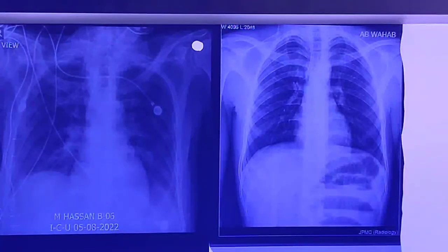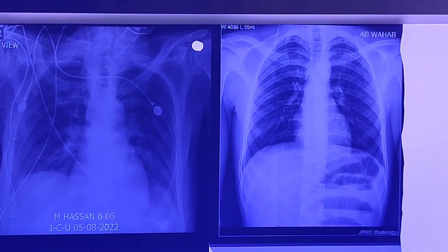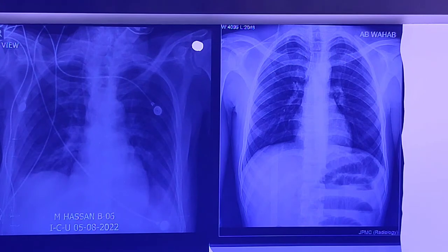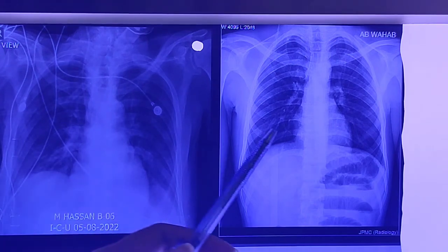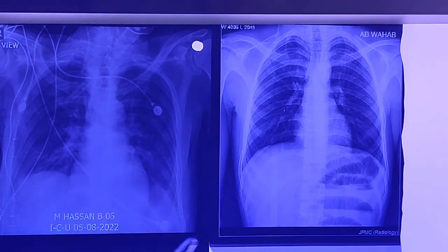Assalamualaikum friends, welcome to Asing Surgery. Today we are discussing about the chest x-ray, and here I am going to differentiate between the AP view and the PA view.